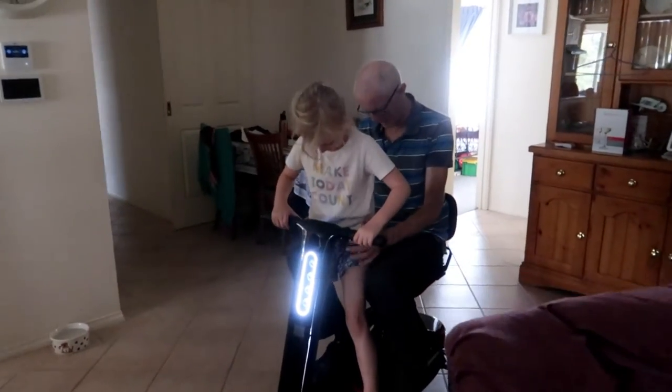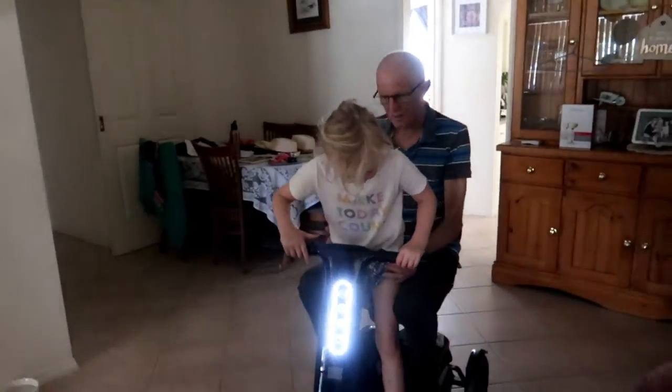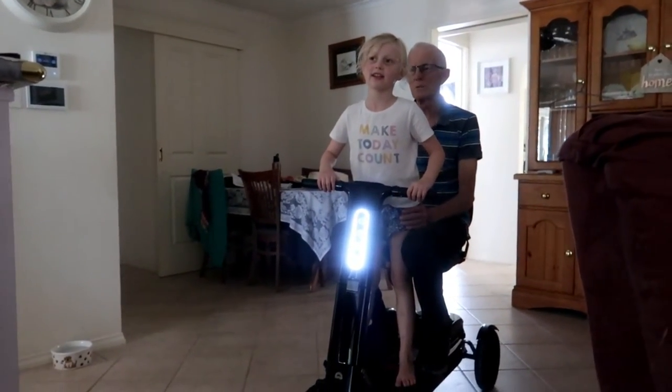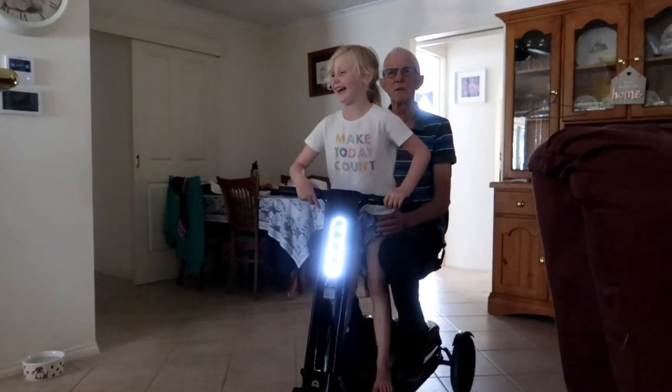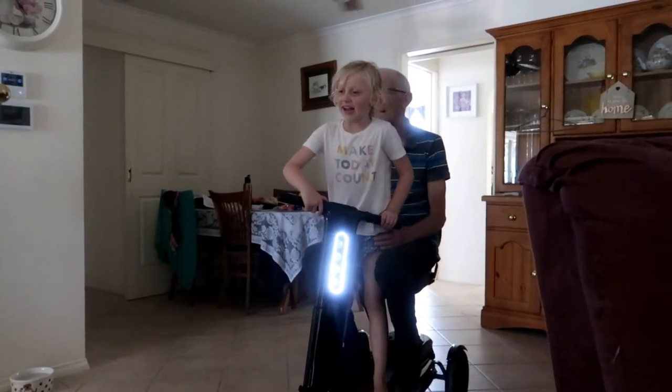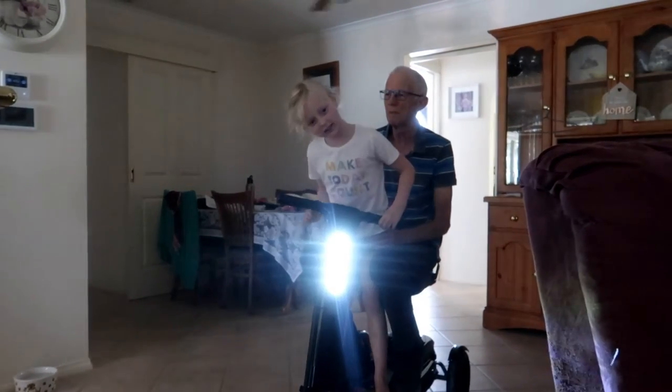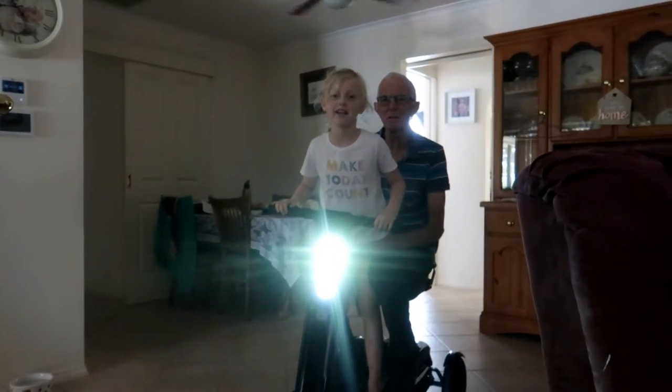Oh, you can ride with Pa! You can just stand there — look at that, how nice. She can drive and Pa can just go for a carriage ride. Pa can steer — 'I'm the pilot.' Very cool! Well, I hope you enjoy it Pa — Merry Christmas, Happy Birthday, Happy Father's Day!